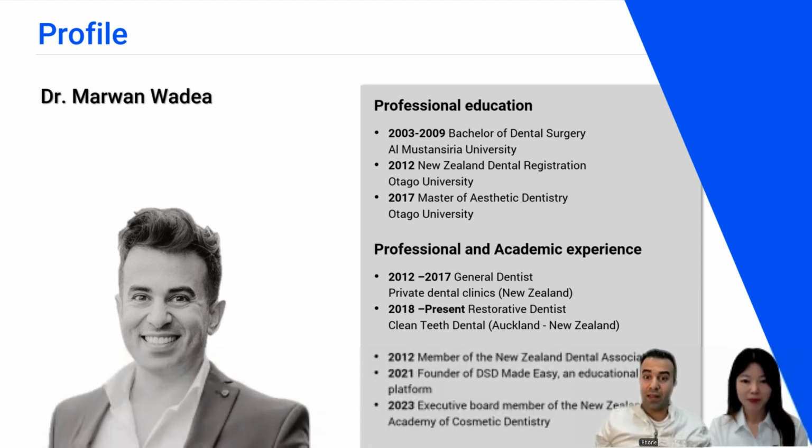It is Medit, it is for dental, while Mesh Mixer is generic for everyone. It's technically for 3D designing and sculpting. Once I moved to Medit, I learned how to use the applications, and then it is limitless, and that's the beauty of digital dentistry.